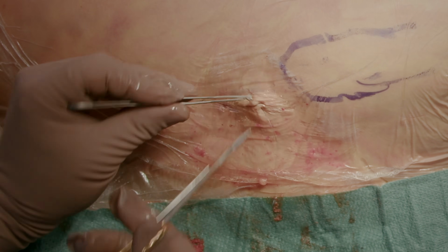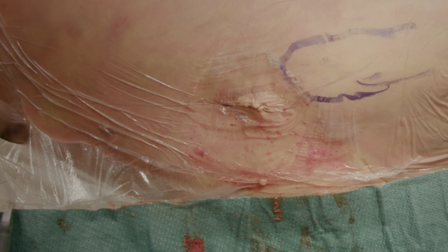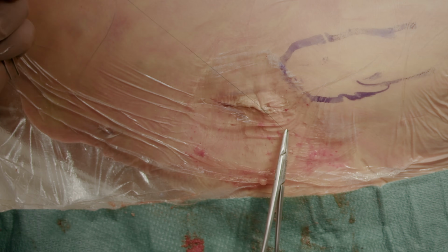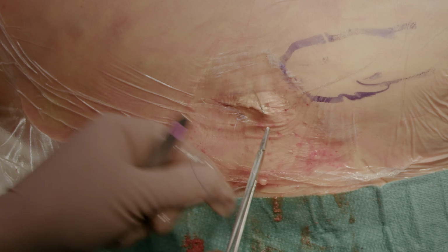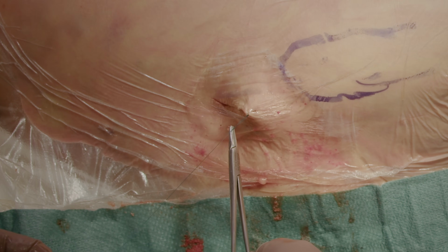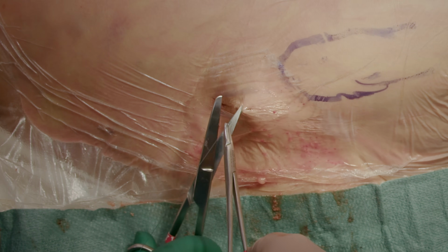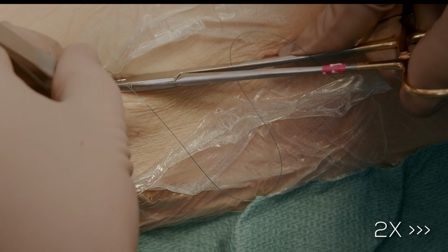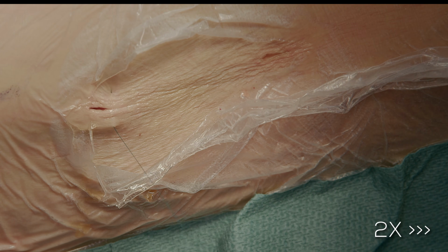It is also possible to close the skin using surgical staples. Closure of the skin alone is enough for the distal wounds.